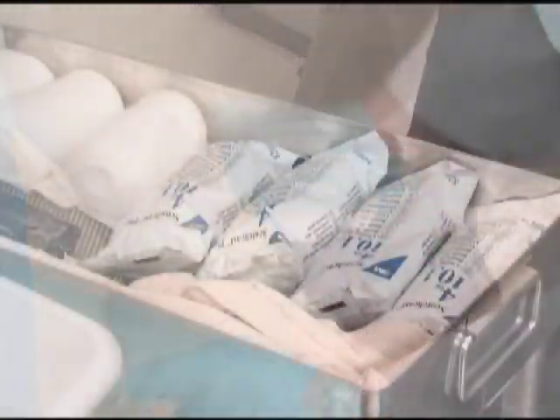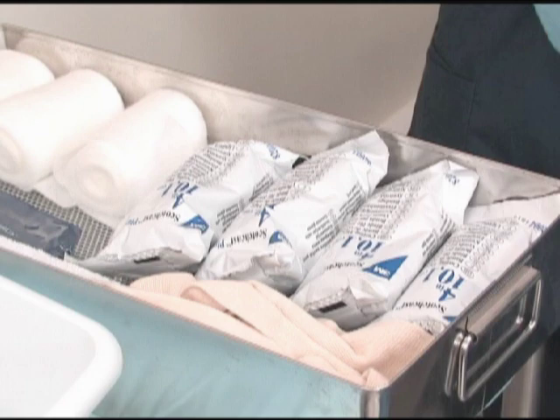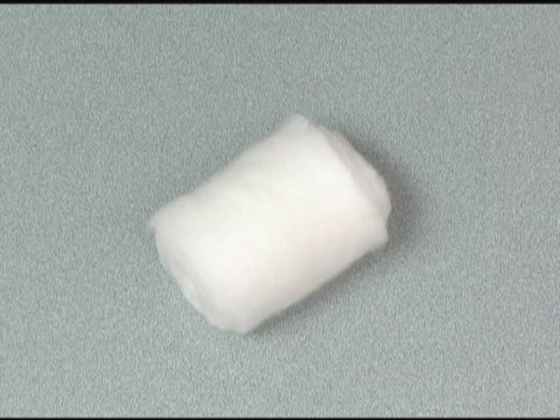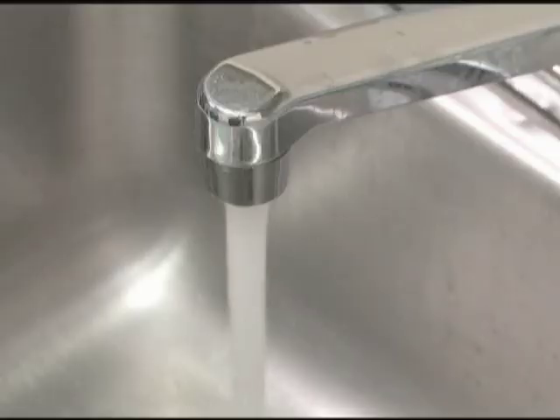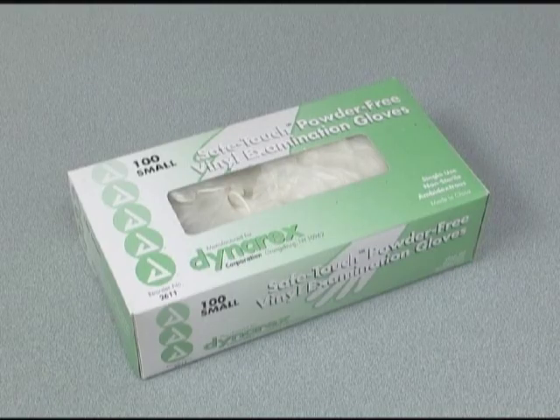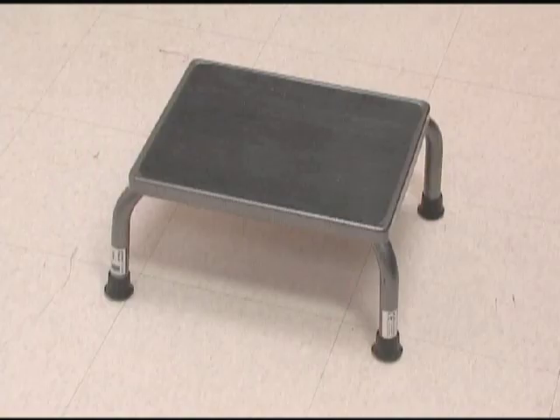Materials you'll need for this procedure are rolls of fiberglass casting material, stockinette, padding, blunt and or sharp-nosed scissors, warm tap water, a 2-4 liter basin, disposable gloves, a stool or low chair for support if casting a foot or lower leg, and if needed, patient drapes and the patient's chart.